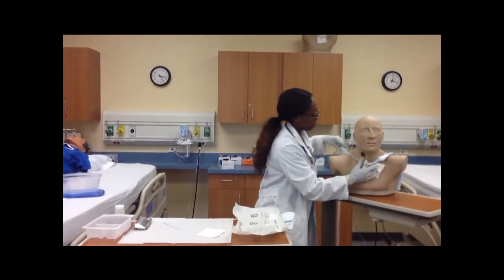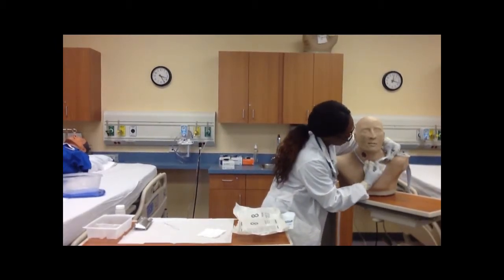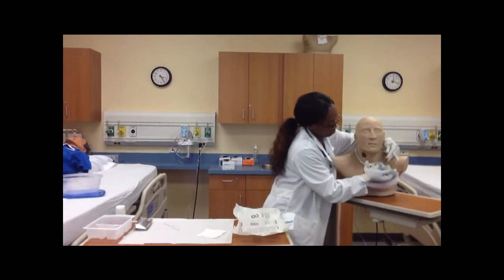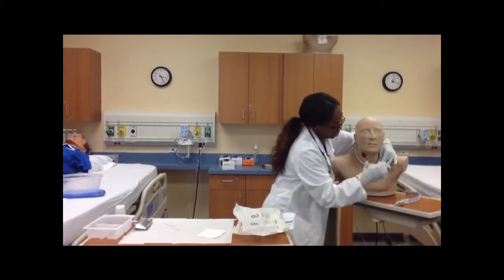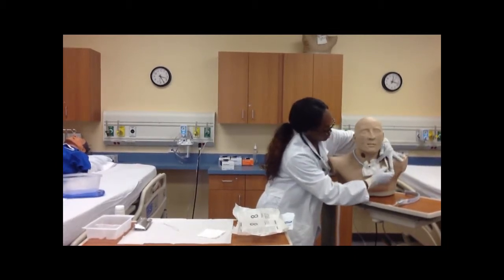And I just bring it around the patient's neck. I can remove this portion of it. Place the old necktie here. Wrap it around this side.